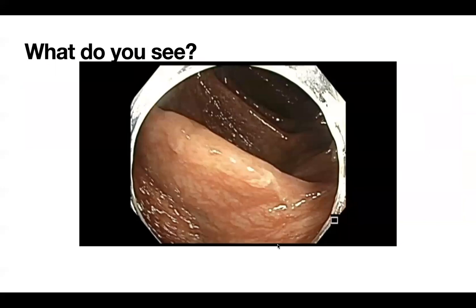Raju, back to this case, did they say what the issue was, why they didn't resect it? Why they didn't remove that polyp and just biopsy? I don't know. Reflecting on my own experience doing this case, I can say that the endoscopist must have had a tough time maintaining a stable position.